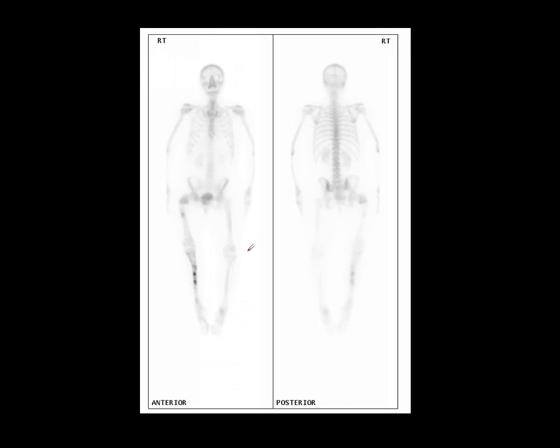I've lightened up this bone scan because there are a couple of points I wanted to show you. We've got focal areas of increased activity in a rather unusual distribution for metastases — it's all down one particular limb, what we might call monomelic. That's rather unusual. And also, even on the scintigram, you can see there's some kind of modelling deformity of the femur. It doesn't have the classic angle of the femoral neck and diaphysis — instead, it has a shepherd's crook deformity.